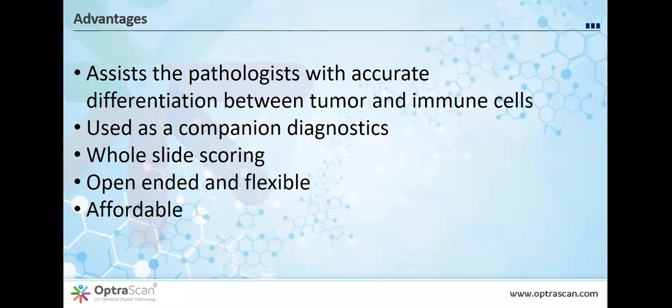And so people looked at the HER2 test, which was for breast cancer, which, if you go back and think about it, was actually approved in 1998, 22 years ago. And it was approved on a 1+, 2+, 3+, looking at membrane or partial membrane staining on cancer cells. HER2 was a very simple test compared to PD-L1, because PD-L1 is complicated by immune cell staining.